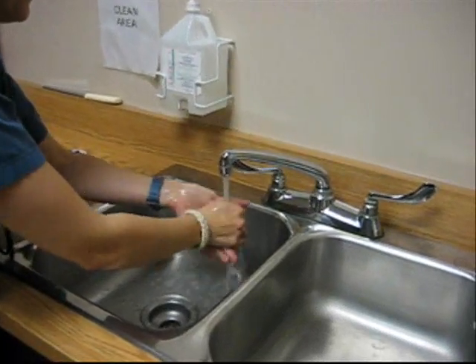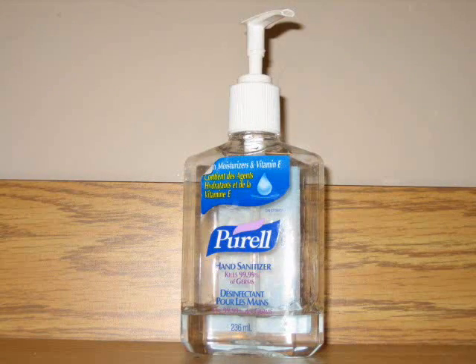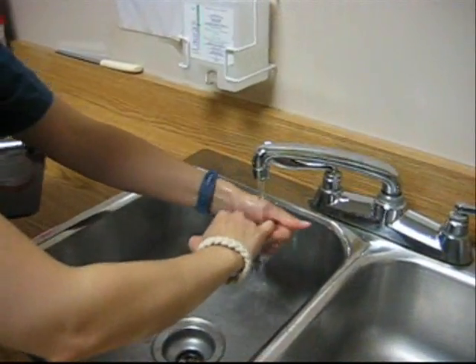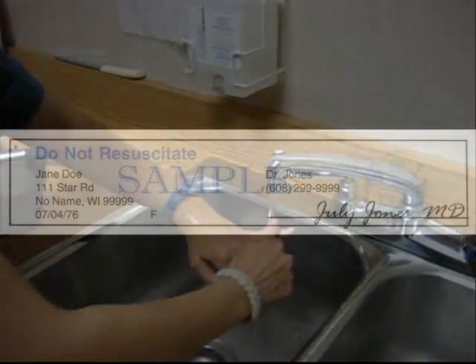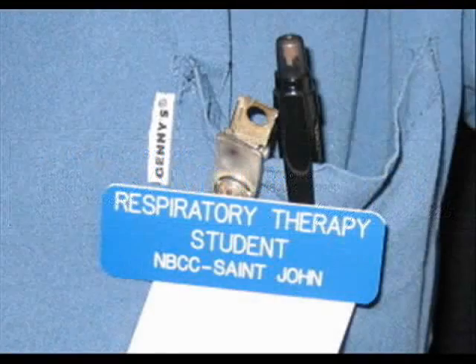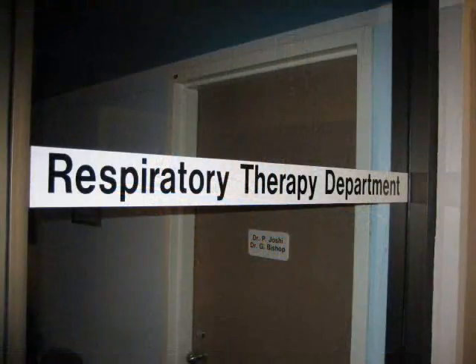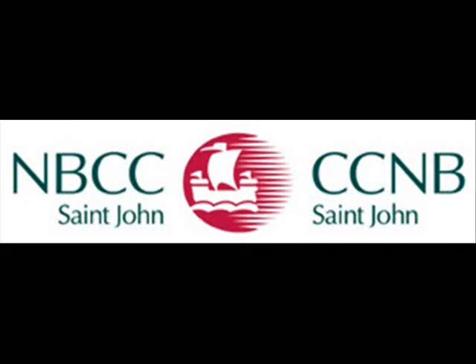Use aseptic technique throughout the procedure. Wash hands at a sink or with an approved alcohol-based product. And don gloves for all aspects of the procedure at the patient's bedside. Identify the patient, yourself, the department that you represent, and your role as a respiratory therapy student at NBCC SJ.